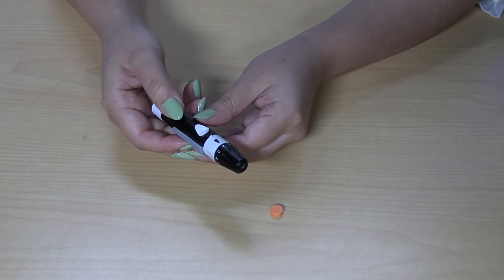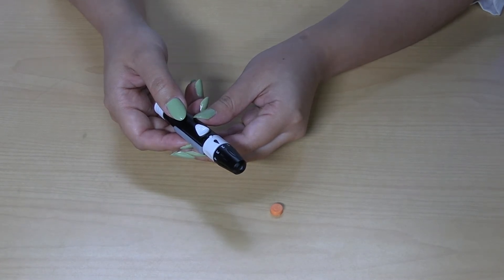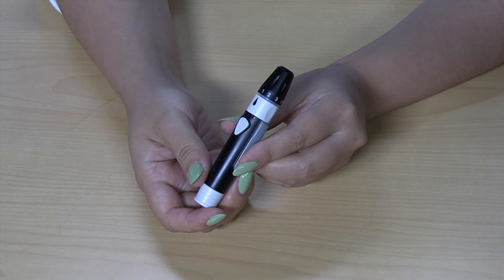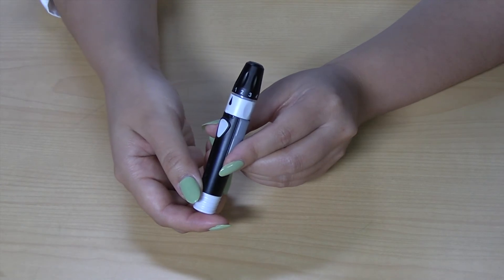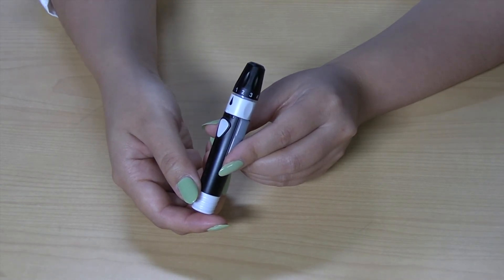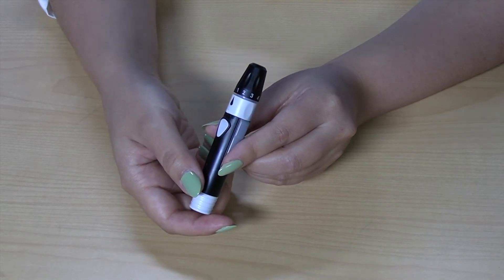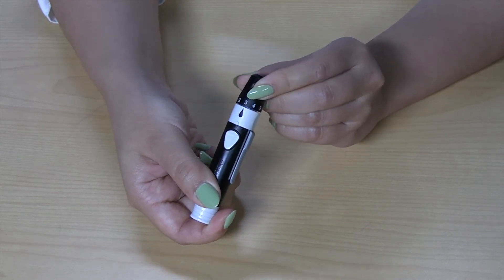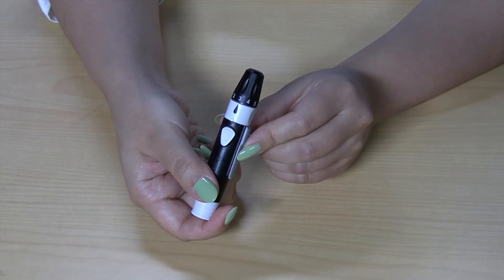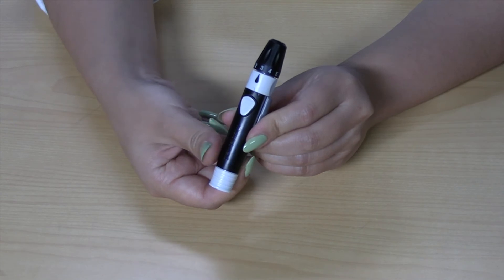Some lancet devices differ in how to load the lancet, so refer to the instructions on your particular lancing device. You will notice some numbers on the device. Each number signifies how deep the needle will go into your finger when poking. The bigger the number, the deeper the needle will go. Two or three is best for most people, but you can go higher if you have thick, callous skin. We will do a three. Pull back the white bottom part to activate the needle. Now that it's ready, set it aside.